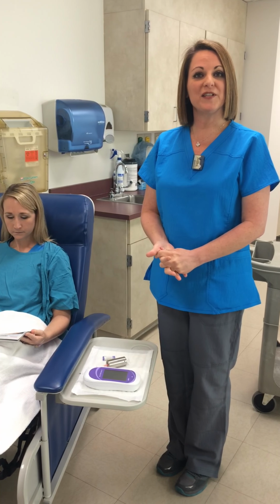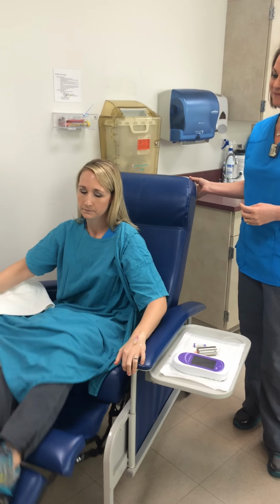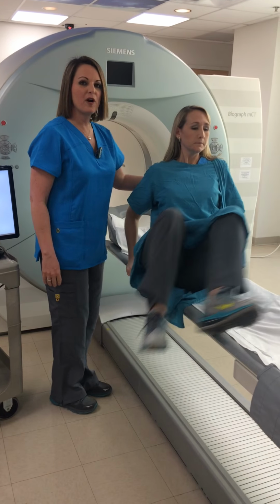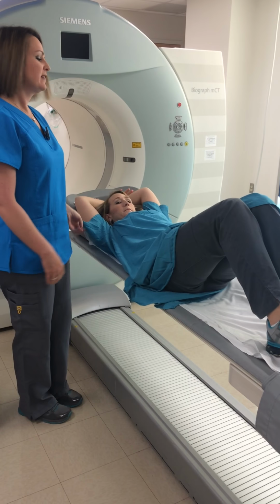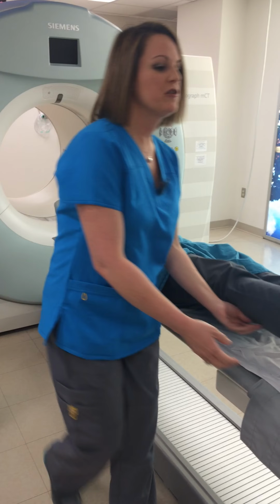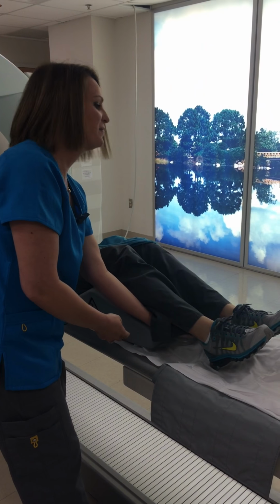The third and final stage is the imaging. For the scan, the patient will be laying on their back with their arms above their head. This is important that they have their arms up because we're able to see the lymph nodes a little bit better underneath of the arms. We try to make them as comfortable as possible by putting a nice cushion underneath of their knees.